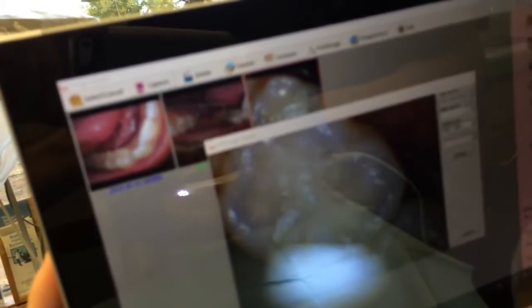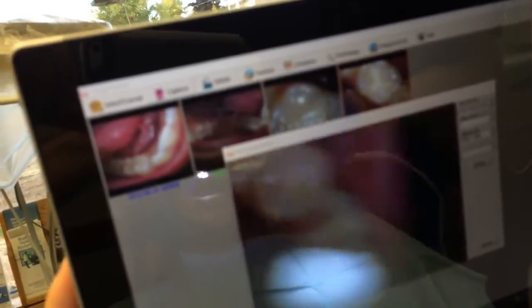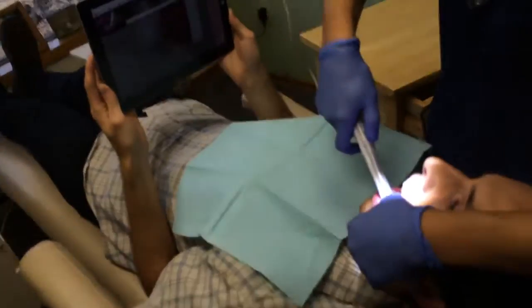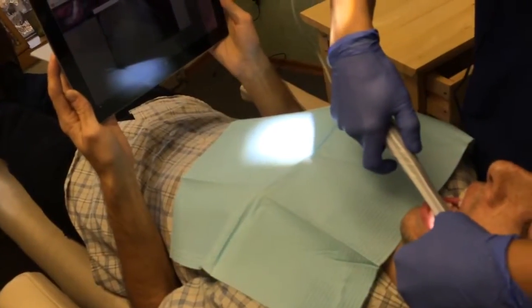That's what I want to see, and that's what I want to do. I want to have a close up. I think after a while you kind of learn how to do this better. You probably want to rest on the teeth, and then move to where you want. How you hold the camera is going to determine whether you get a good shot or not.